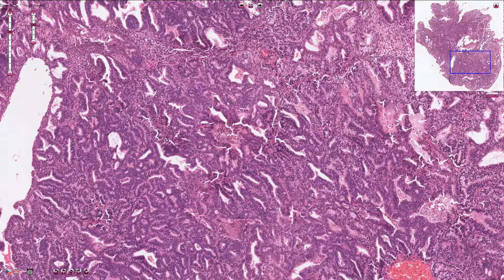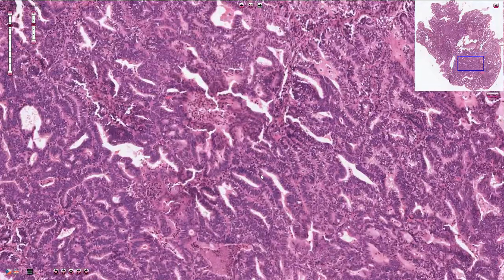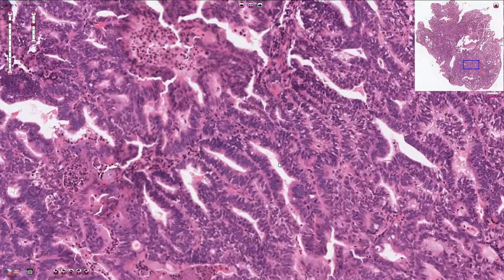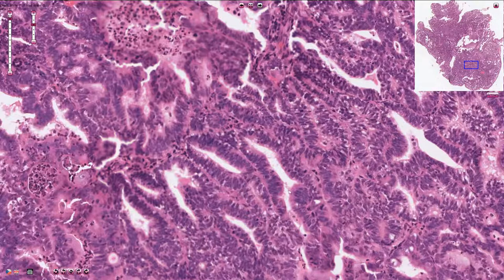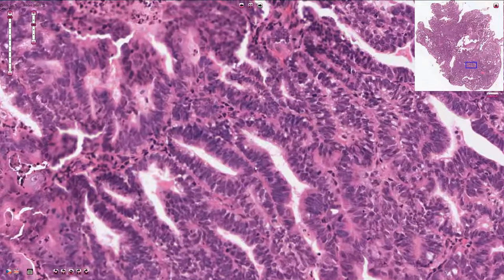This is the typical appearance of well-differentiated grade 1 endometrial carcinoma. The endometrial glands are irregular, complex, and they are back-to-back. We don't see any intervening endometrial stroma, and that is typical for invasive growth and typical for endometrial carcinoma.